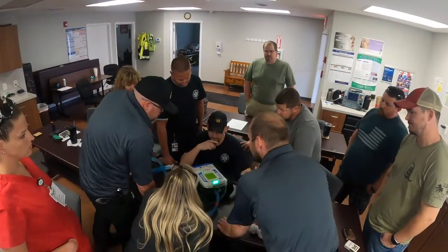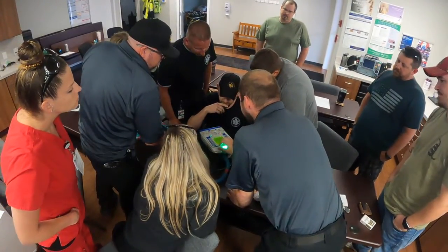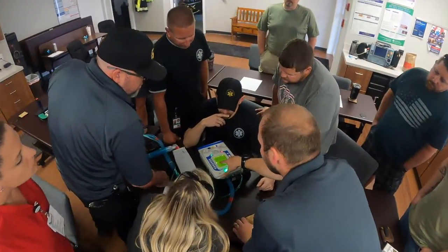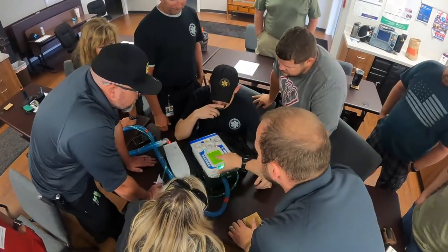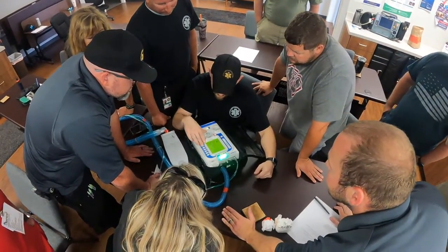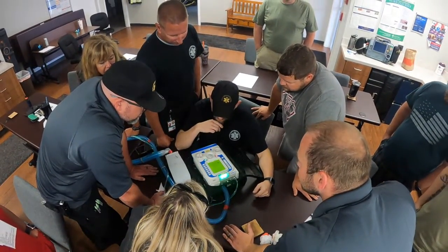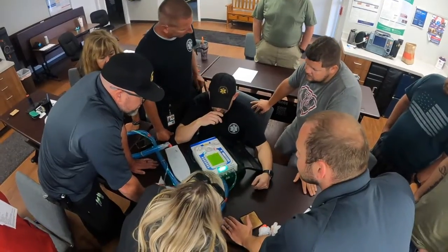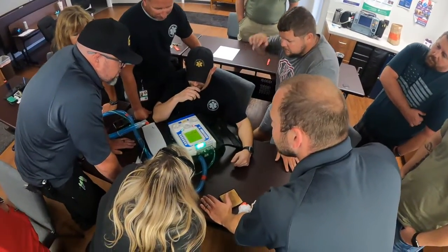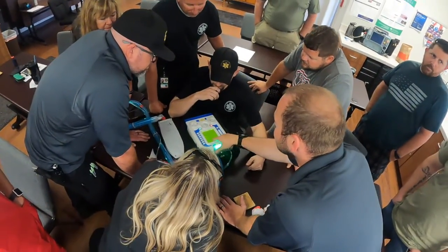I got a question. How do you change your trigger? I will show you. Volume right now, because it's highlighted, we can control. So Bobby, go ahead and change our 450 to 500, and let's see what happens with our PIP. Okay, right now, 25.